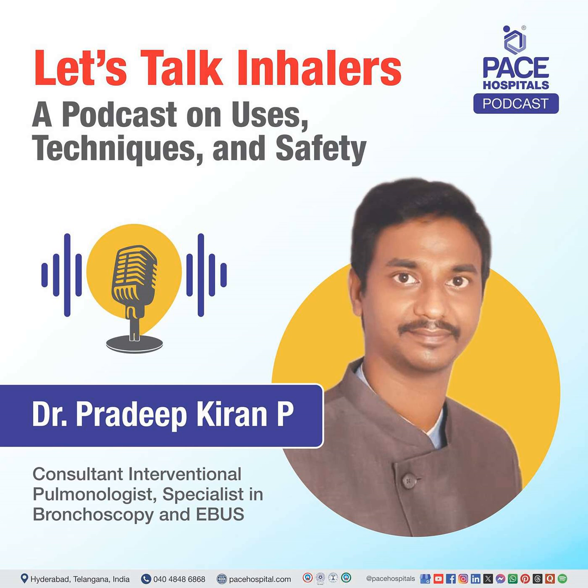So automatically there's a blister under it, so that the drug will come once you inhale. Okay. So once it is finished, your trigger will automatically come up. That indicates that your dose has been successful. Now after finishing it, the same thing, again close it. That's all. As with MDI, DPI, once you have taken a dose, you have to rinse your mouth.